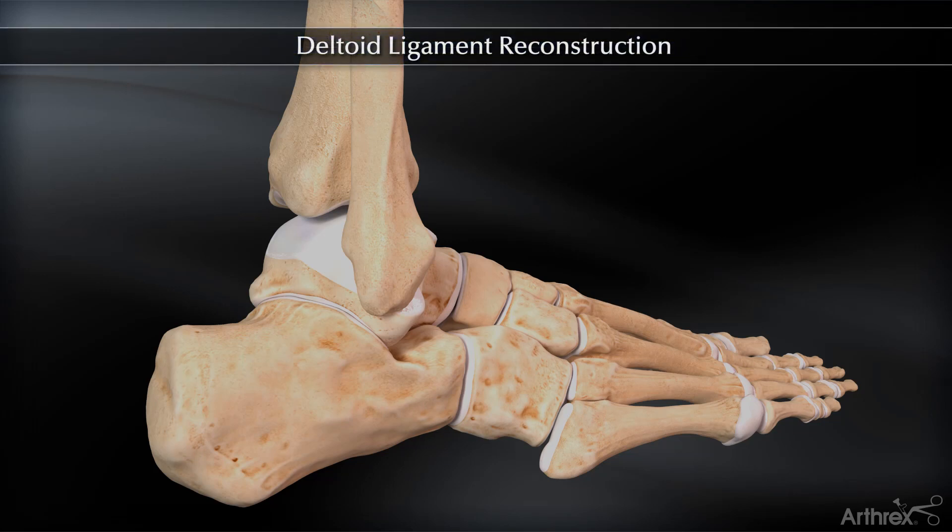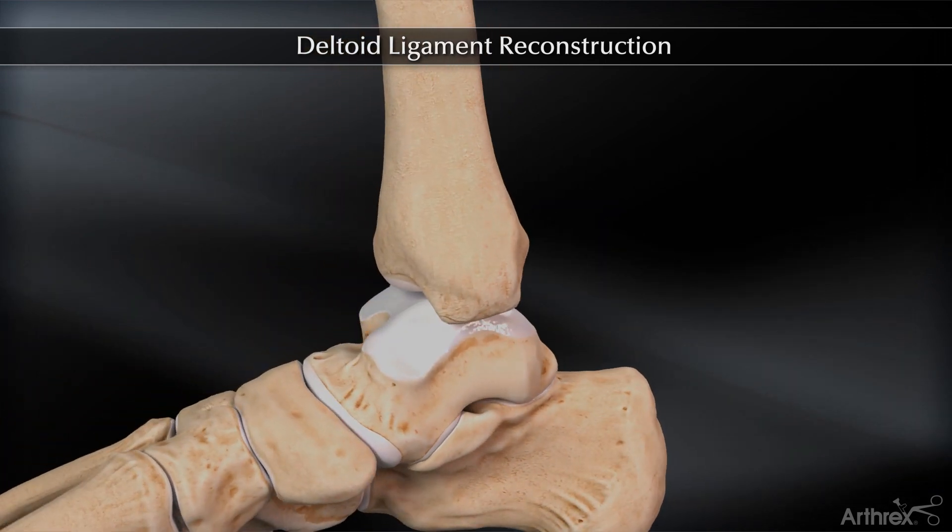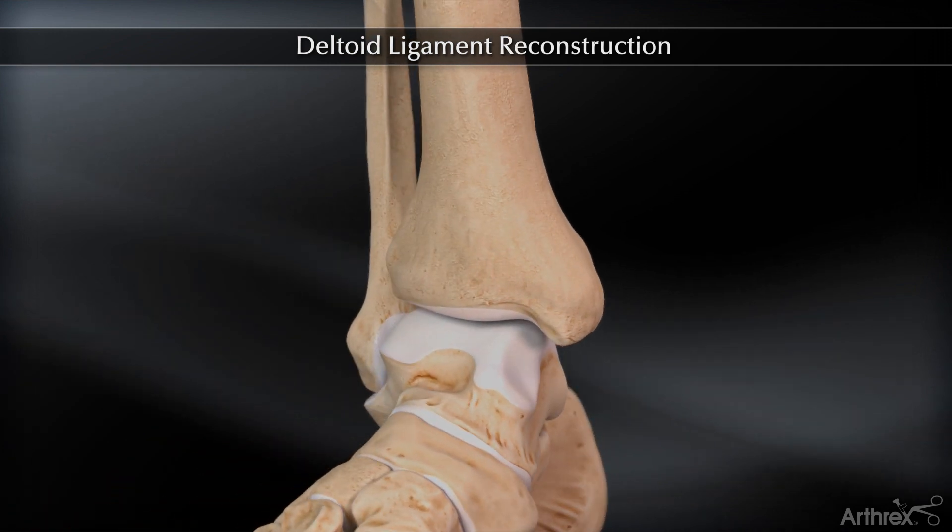Arthrex presents the deltoid ligament reconstruction technique utilizing the deltoid ligament reconstruction implant system. A 4-6 cm incision is created to visualize the insertion sites of the deltoid ligament on the medial malleolus, talus, and sustentaculum.